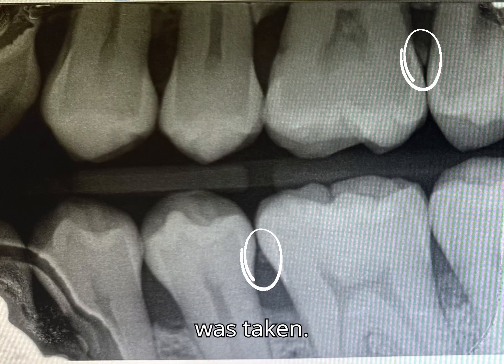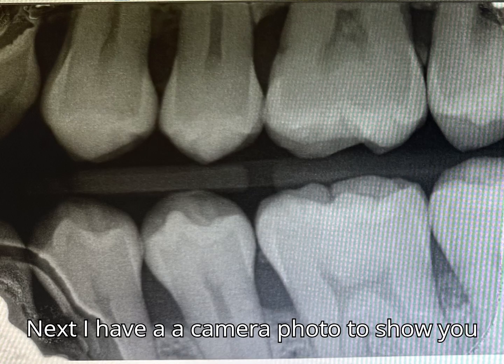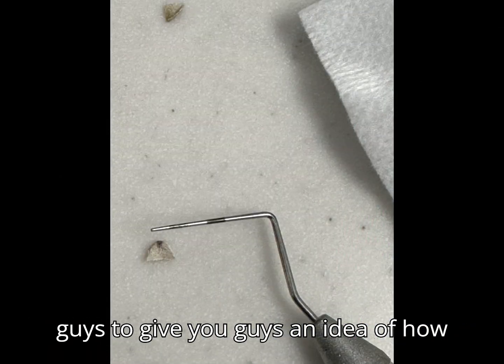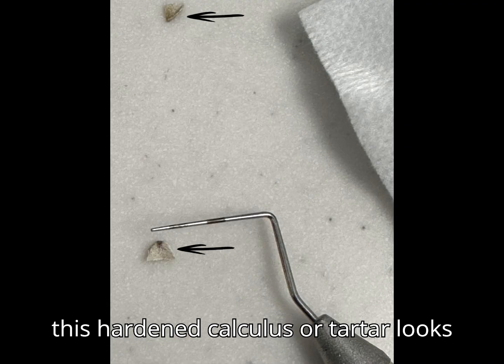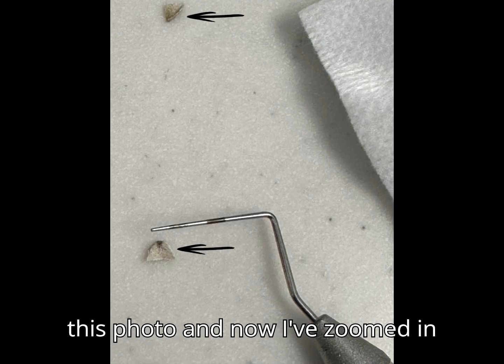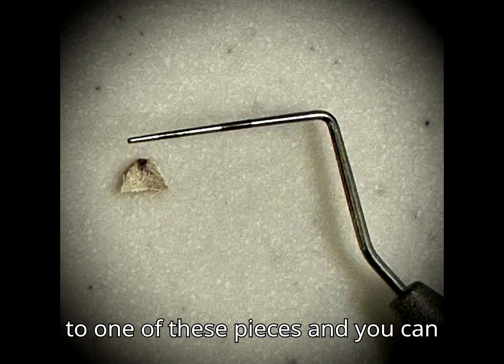Next, I have a camera photo to show you guys to give you an idea of how this hardened calculus or tartar looks like. You can see two pieces of tartar in this photo, and now I've zoomed in to one of these pieces.